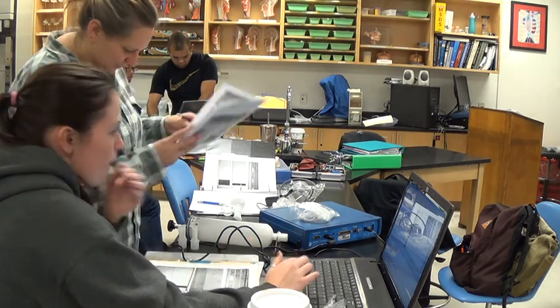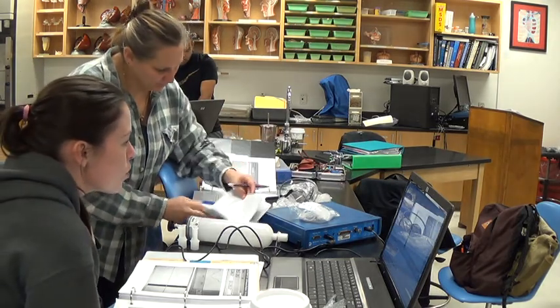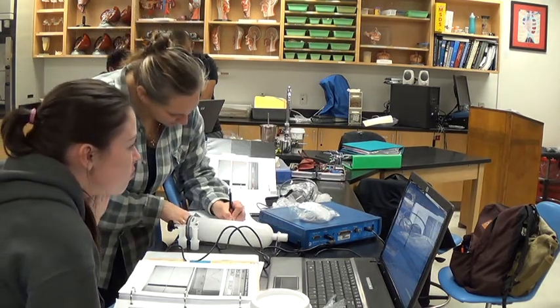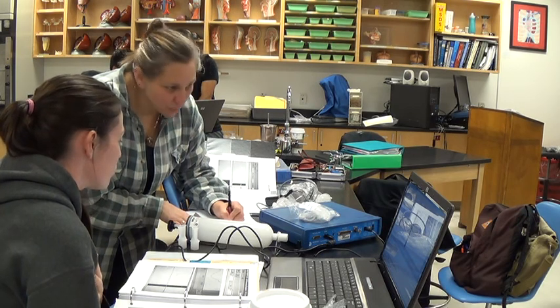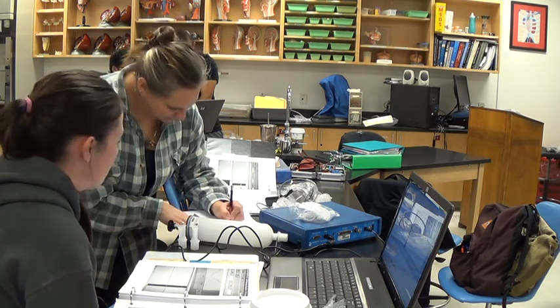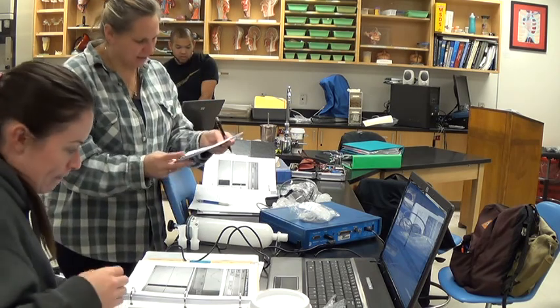So what was our forced expiration time again? I haven't done it yet. Probably just going to use tidal volume. That's not what it was. I just want to do it to see how much of a windbag you are. So when we divide them, Professor, is that our forced expiratory volume? Okay. Well, the forced expiratory volume is at 1 second.